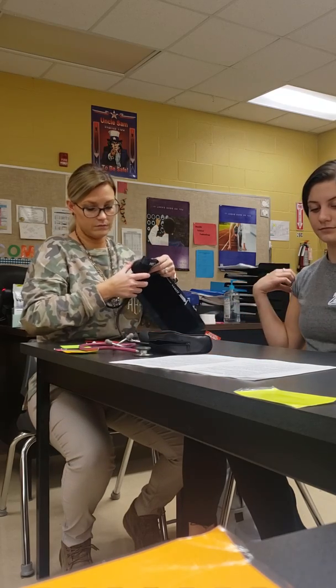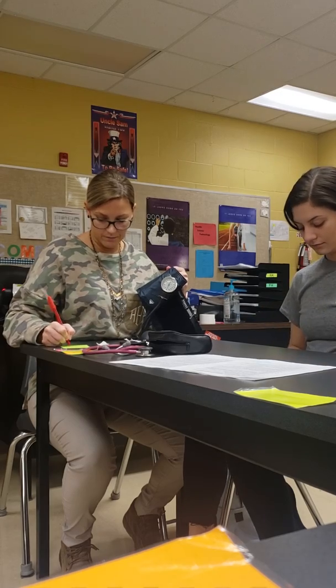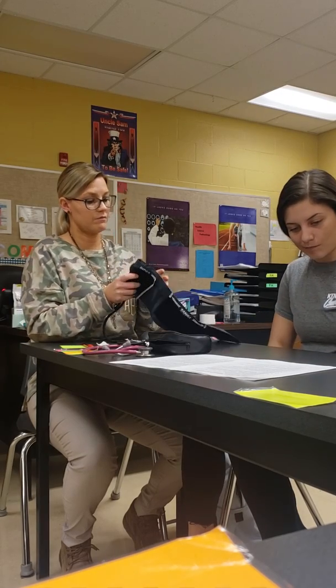Then you record the blood pressure on the paper, which you already did. 114 over 60. Then you're going to record the reading. It must be within 4 systolic and 4 diastolic, attained by the evaluator, and perform hand hygiene and record and report observations to the nurse. I'm going to wash hands, report, and record.